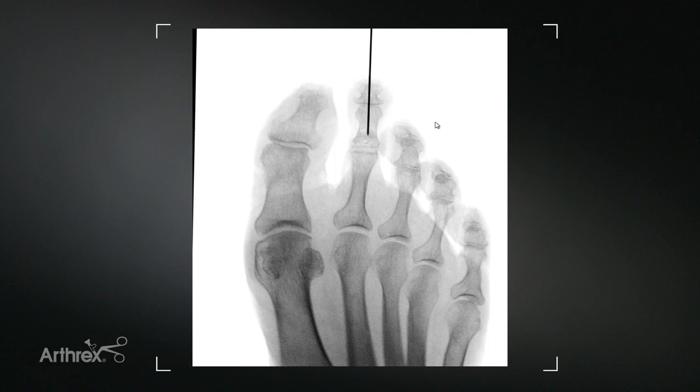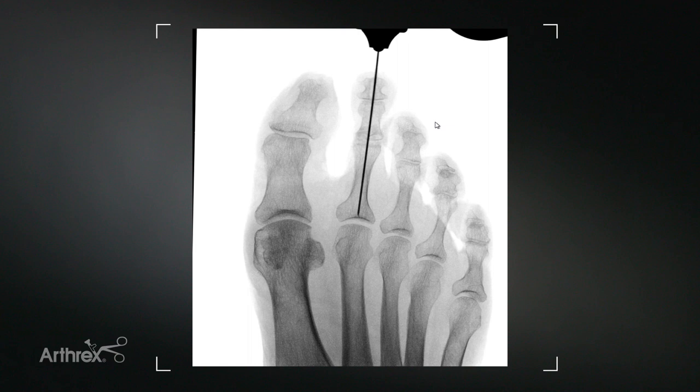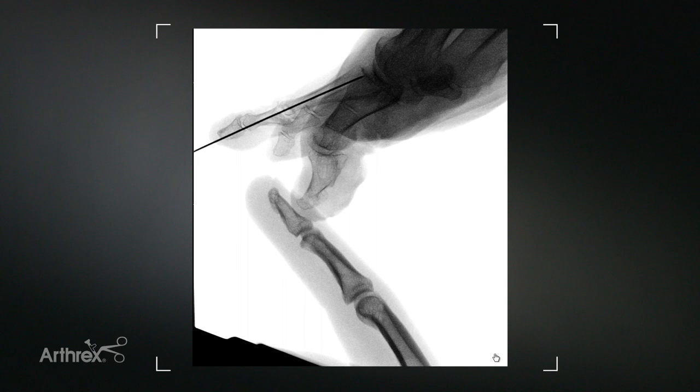At this point, you can see the guide wire is centralized, and now you just have to traverse the IP joint in the proximal phalanx. It's important to stabilize the IP joint when you're advancing this wire. You'll know that you're centralized when you hit the base of the phalanx, and you'll feel it as your guide wire is inserted. The next step is to check a lateral view to make sure you are midline.